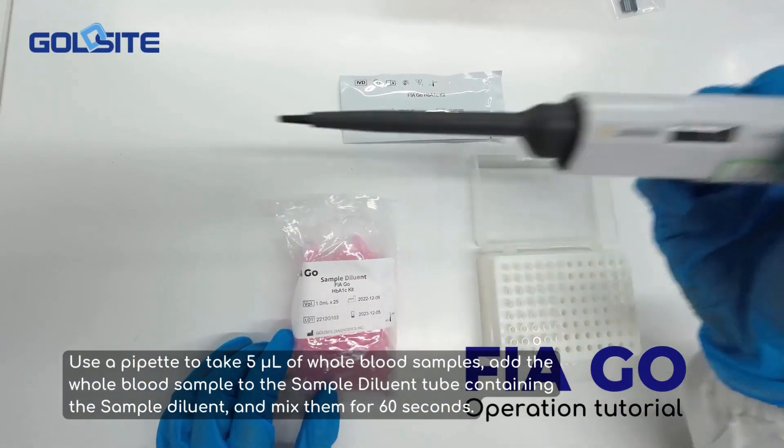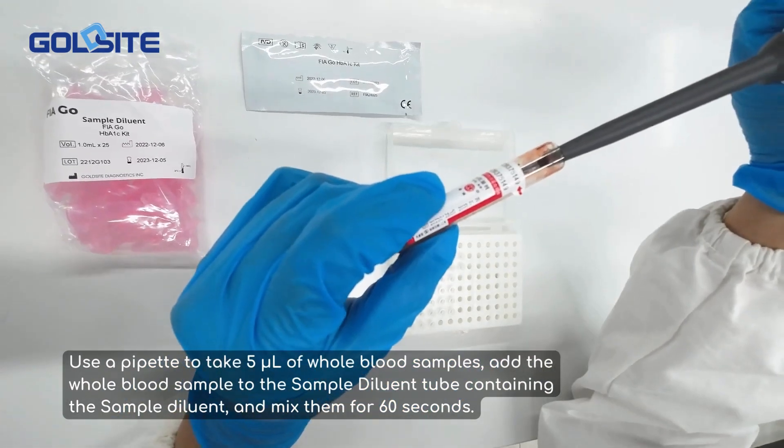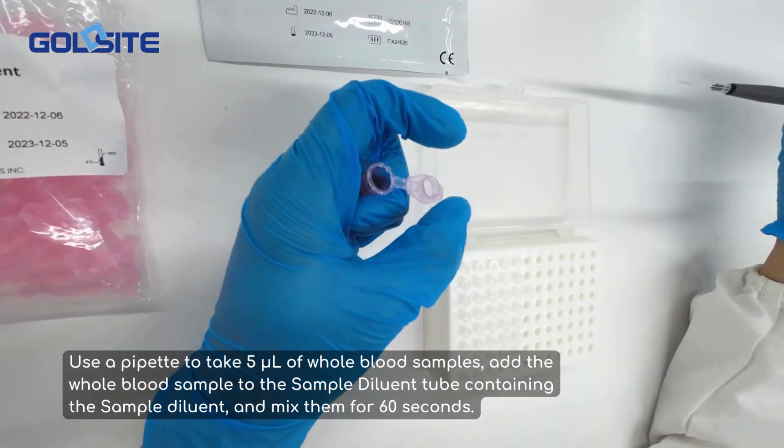Use a pipette to take 5 microliters of whole blood sample. Add the whole blood sample to the sample diluent tube containing the sample diluent, and mix them for 60 seconds.